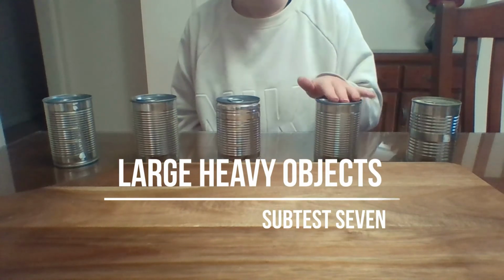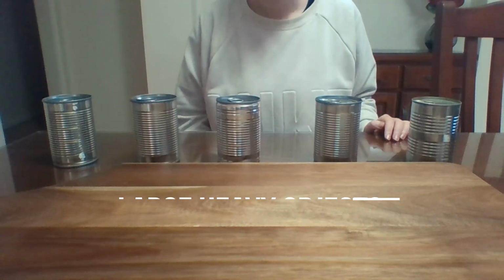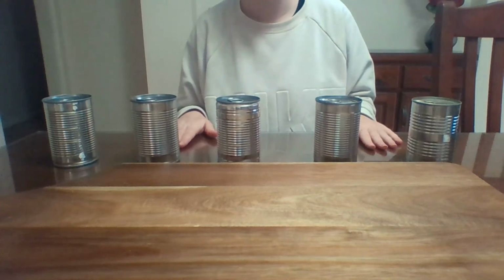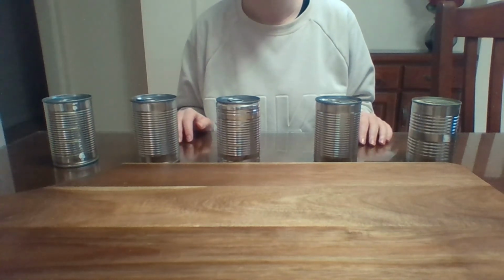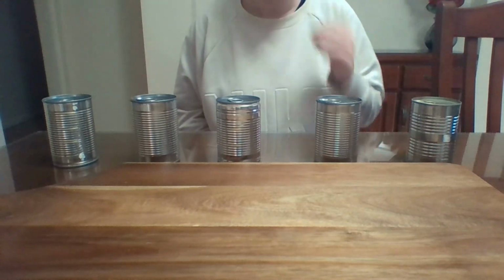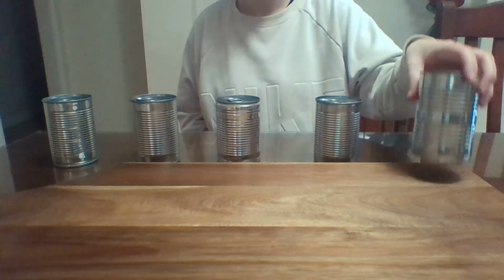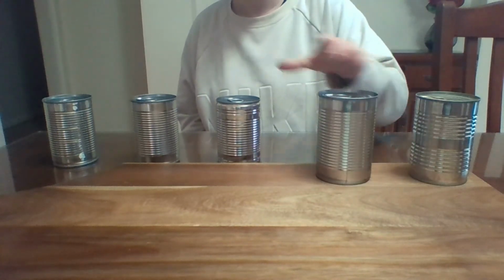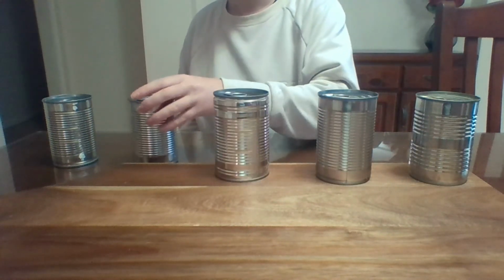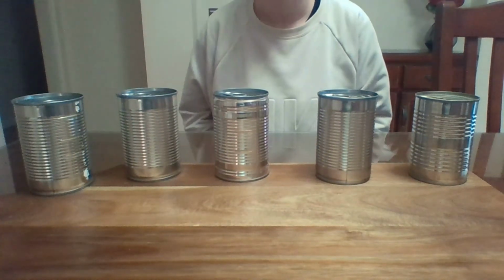5 full 1-pound cans are placed on the table 5 inches from the edge and all 2 inches apart. They are placed just in front of the board which is clamped to the desk. The participant is asked to place each can on the board one at a time and as fast as they can, while the assessor records the time. This is then completed on the dominant side and set up in the same way.